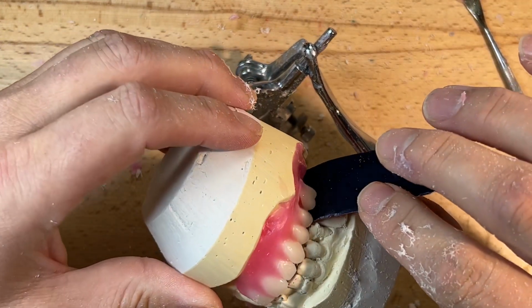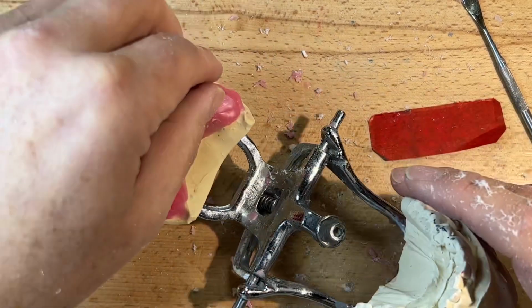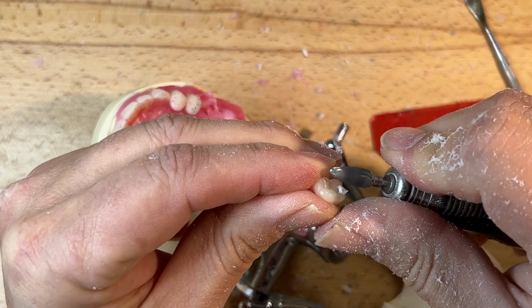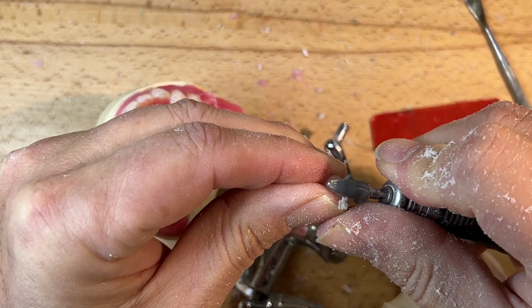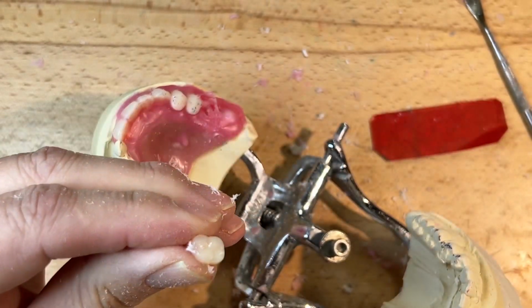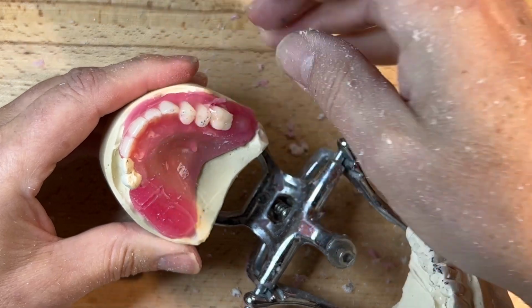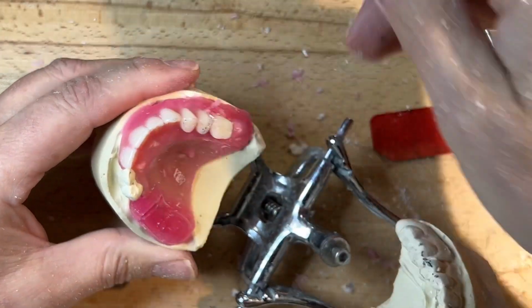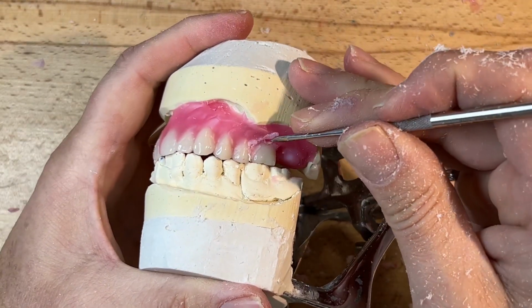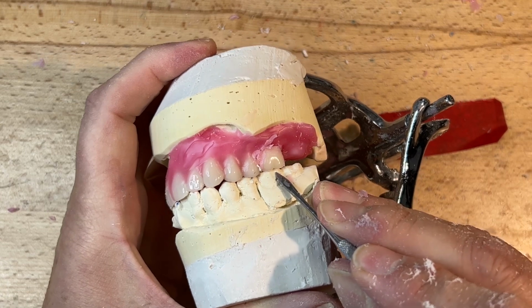But the lower teeth, I'll just do a little bit of a customization of these denture teeth to reduce the inclined plane of the buccal slope and kind of widen the occlusal table without making it a 0 degree to kind of maintain the spillways of saliva and food, because this is going to increase, again, the chewing efficacy of the client. And you can see I've closed this up nicely, this space.